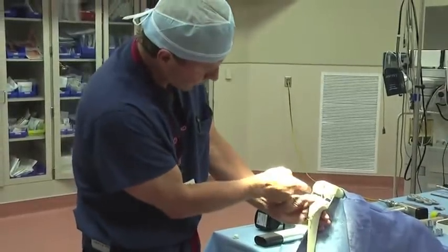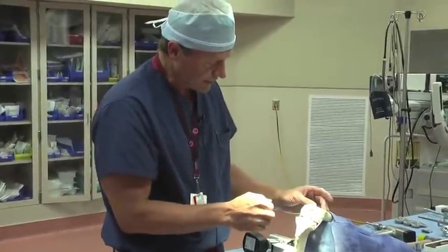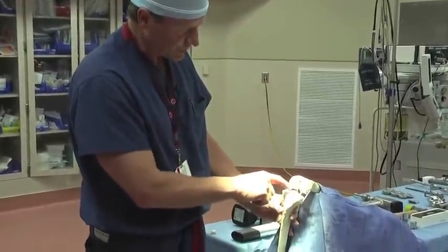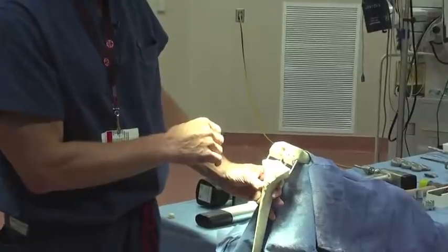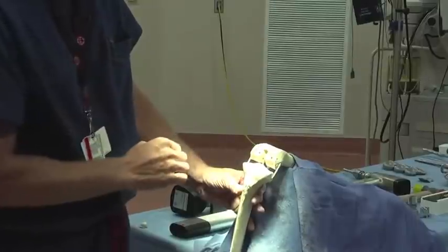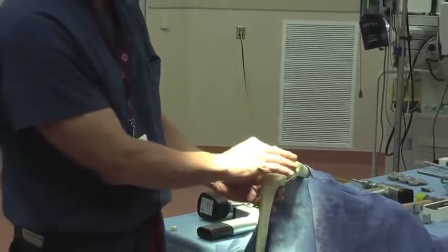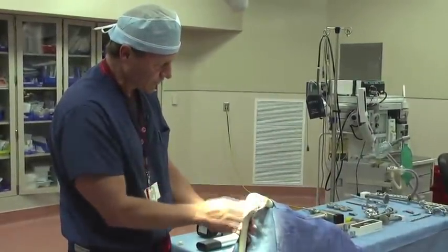After we've removed all the bone, any excessive spurs that are on here we'll take out as well. This model doesn't demonstrate it, but there are some ligaments — this represents the posterior cruciate ligament, and the anterior cruciate ligament would come up in this direction here. With this particular implant, we would go ahead and take those two ligaments out if they're still present. We would leave our collateral or side ligaments, represented by these bands right here. At that point, we would also remove any remaining meniscal or cartilage tissue, and at this point we've got the femur prepared where we want.